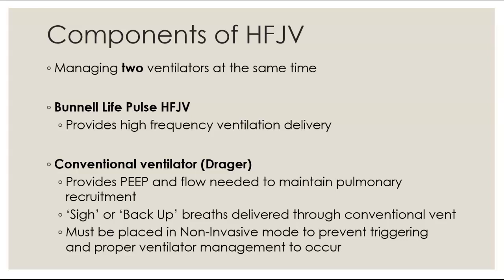So what the conventional ventilator does is we put it into a non-invasive mode. This is so that we don't have the flow sensor at the proximal end like you would in a conventional ventilation setting. Essentially you're just using it to provide PEEP and flow to aid in our pulmonary recruitment. That's why we do it, because otherwise the flow sensor would freak out. It would not like those high rates, it would freak out about PIPs, and it would cause the two ventilators to be asynchronous with each other. So we provide PEEP and flow to maintain that recruitment. It's what essentially is helping to support our mean airway pressure.